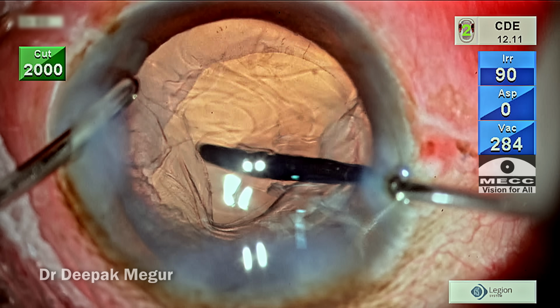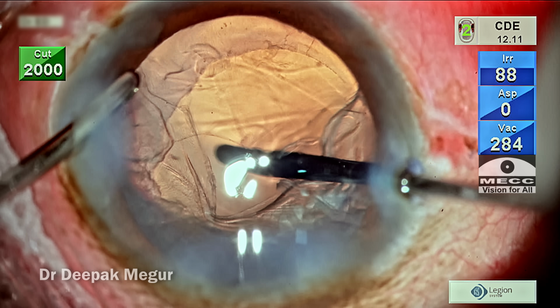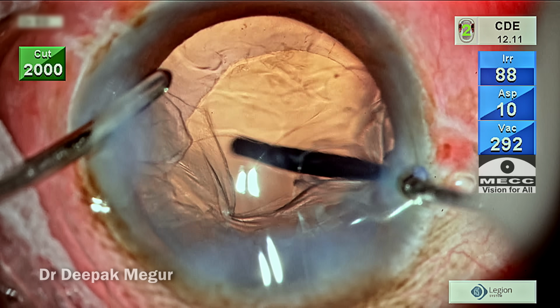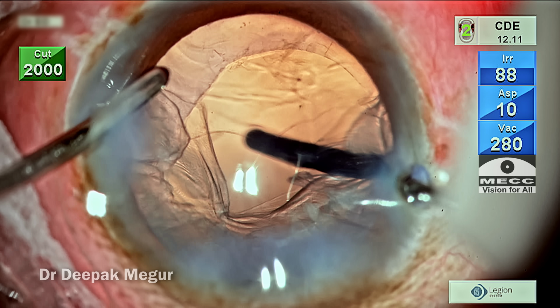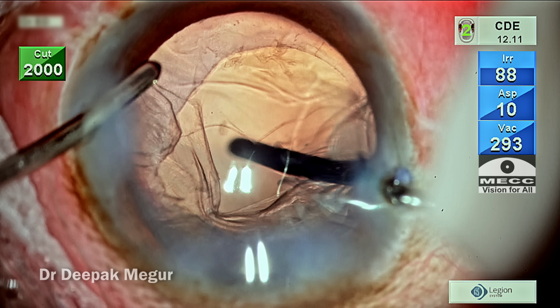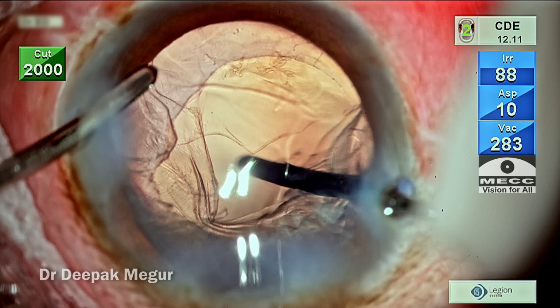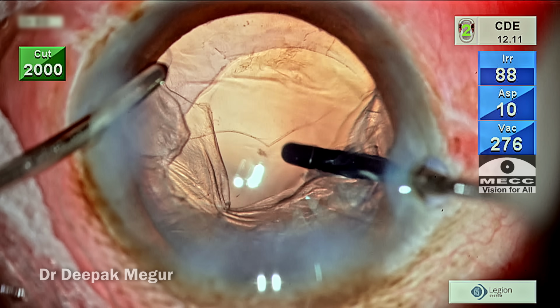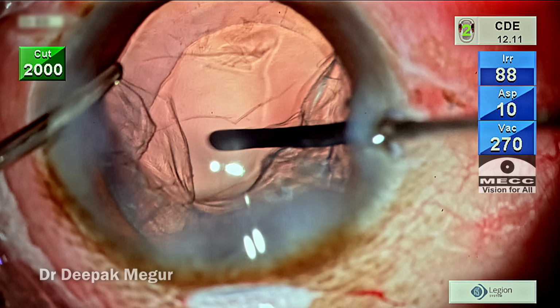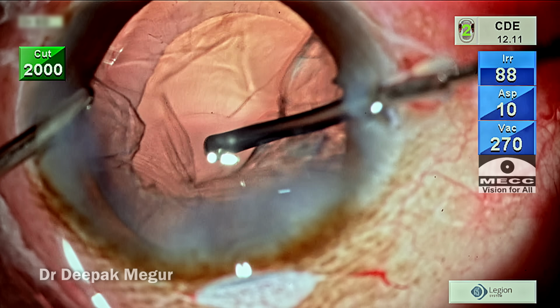So the idea is to cut the vitreous below the level of the posterior capsule tear all around, and the anteriorly prolapsed vitreous will be dealt with later on. The idea is to cut all the connections between the vitreous body, which is posterior, and the anteriorly prolapsed vitreous. By doing so, we can prevent the enlargement of the posterior capsule tear during anterior vitrectomy.